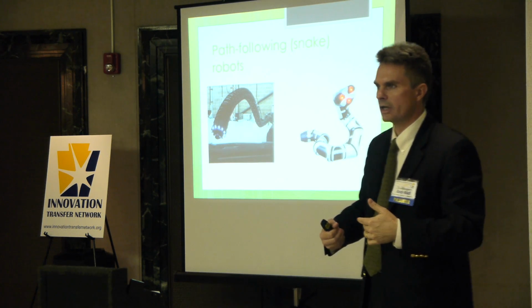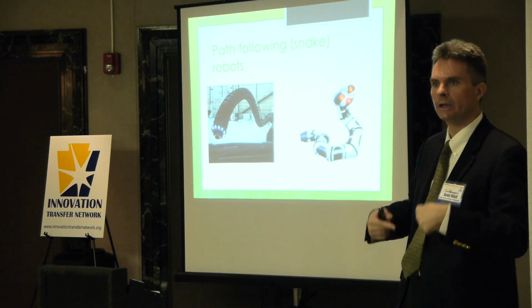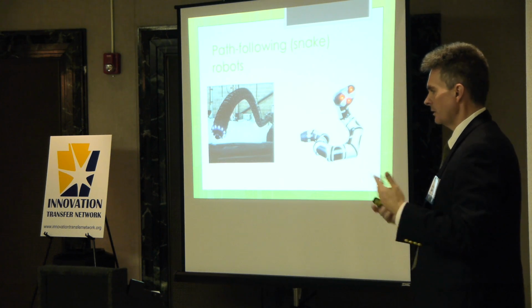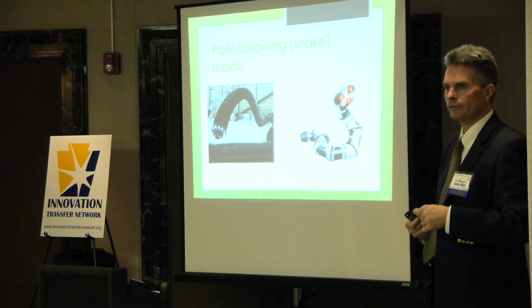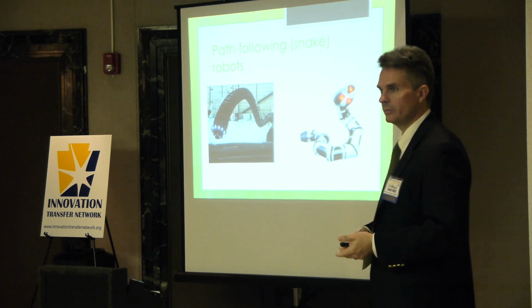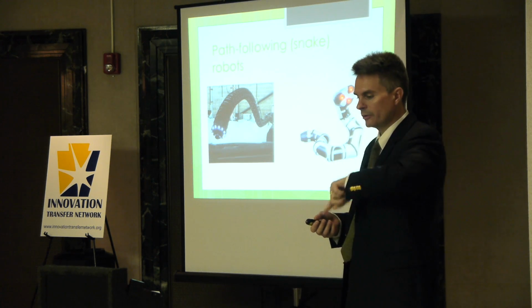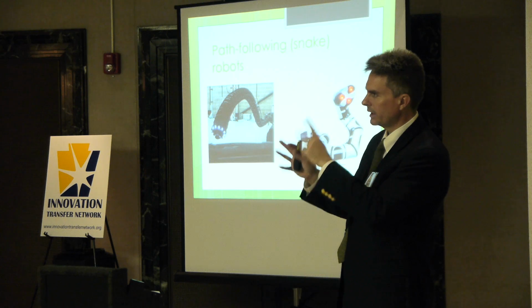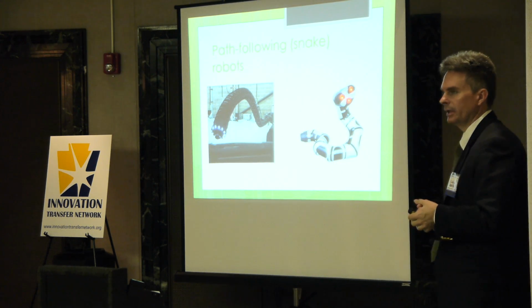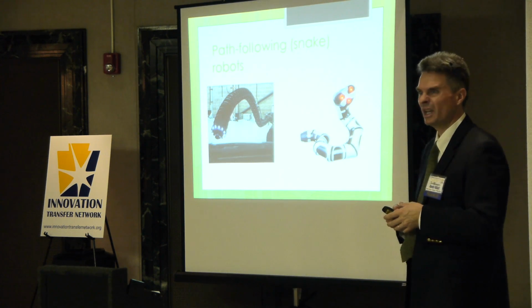As you know, in a lot of straightforward open surgery or laparoscopic minimally invasive surgery, we put holes in people and we put rigid instruments in and accomplish the operation. As many of you may have heard of natural orifice surgery, NOTES, transoral surgery. It would be a huge benefit to be able to take somebody's gallbladder out through the mouth, put an instrument in, maybe a robot, penetrate the wall of the stomach, find the gallbladder, take it out, bring it out. People have done this clinically. I don't know if you heard, it's been on television. Transvaginally removing gallbladders, transorally removing part of the uterus, it can be done.